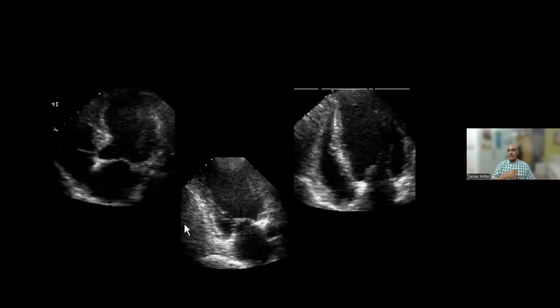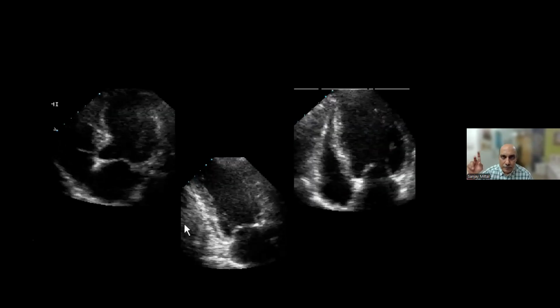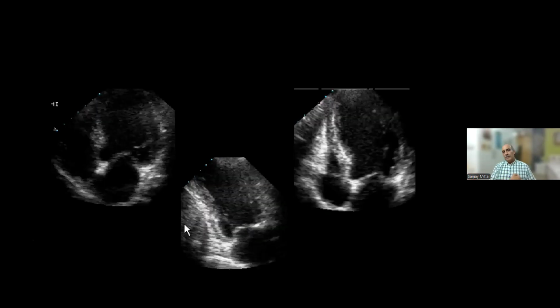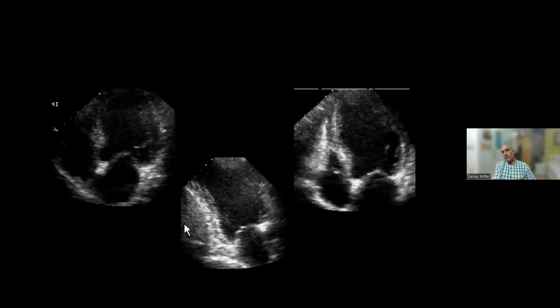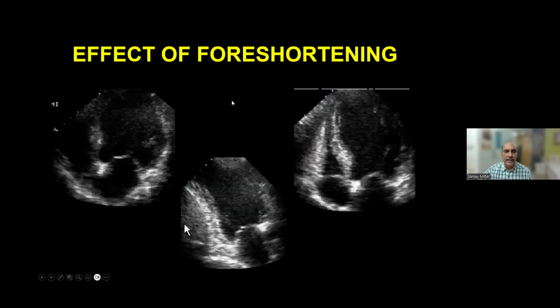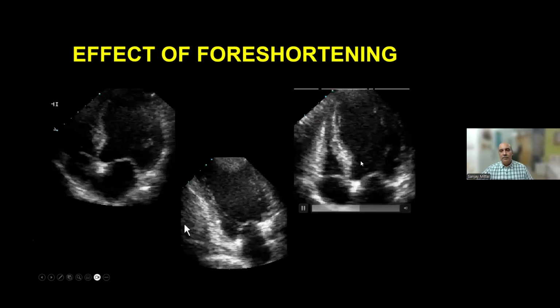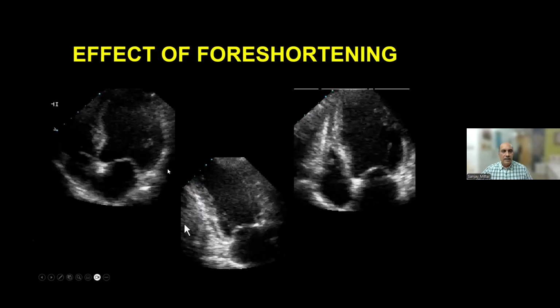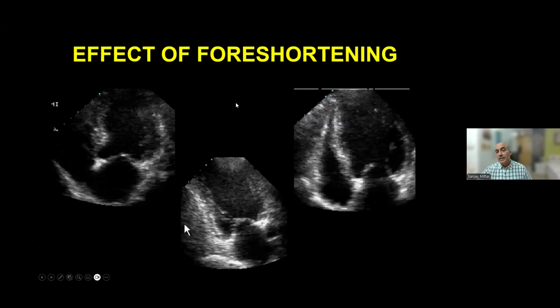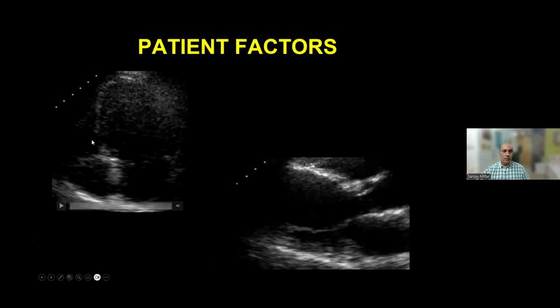That would be right, because we have to look at the outermost, lateral-most portion of the left ventricle, which is the apex beat. And this is only possible when we keep on moving out and down till we lose it, and then we come in and look at the apex. We would not commit such a mistake. So this is the effect of foreshortening. You can easily make a very poor ventricle of 20% look like an almost normal ventricle, and this kind of discrepancy is going to be there. So you have to train yourself, understand what you're looking at, and then make the call.